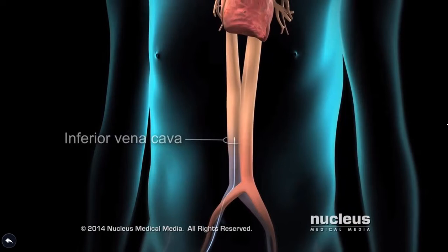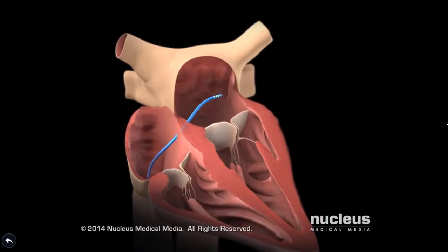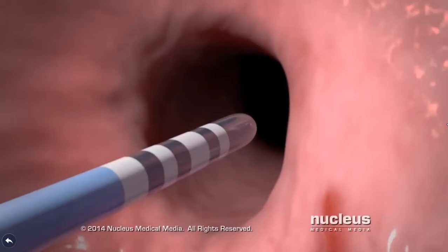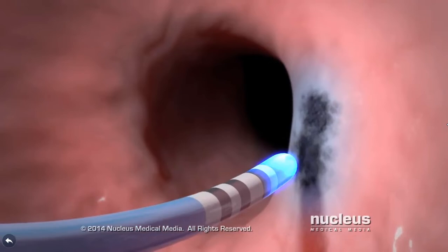The location and progress of the catheter will be monitored. When the catheter reaches the heart, the doctor will guide it to the area causing the arrhythmia, finding the problem areas using a 3D map of the electrical activity of the patient's heart. The tip of the catheter will then emit either hot or cold energy to ablate the tissue in that area, making the treated area stop working.